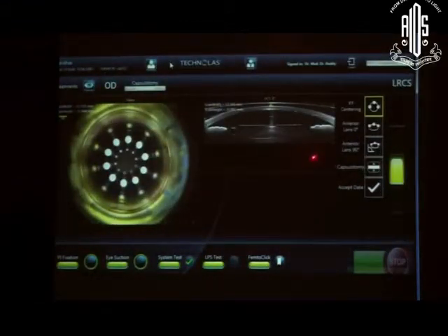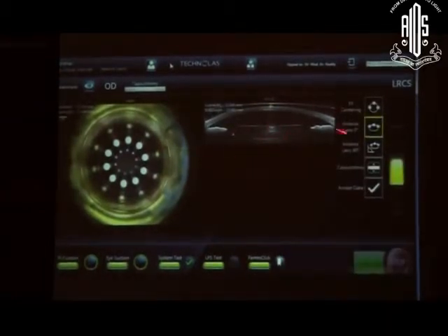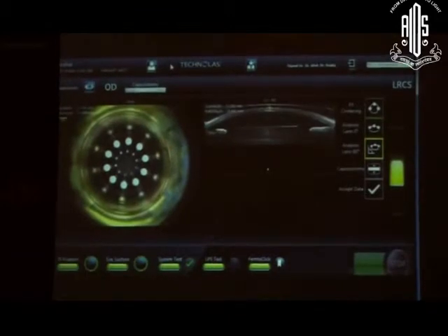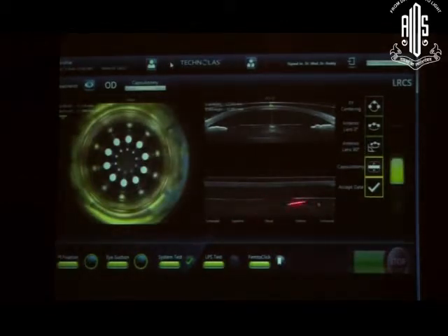Here is a case where the patient had an ICL put in about 7 years ago by me. He lives in Saudi Arabia. So he came back with cataract. So with the ICL inside the eye, I docked the eye, and the only important thing is to identify the anterior capsule, because that is the ICL and that is the anterior. You see how we mark with this machine, 3 spots. And you mark both vertical and horizontal directions, and then you mark the capsule here.